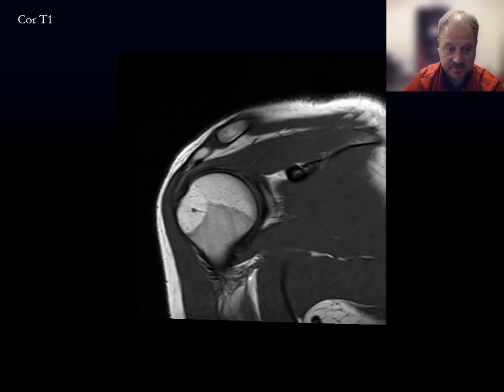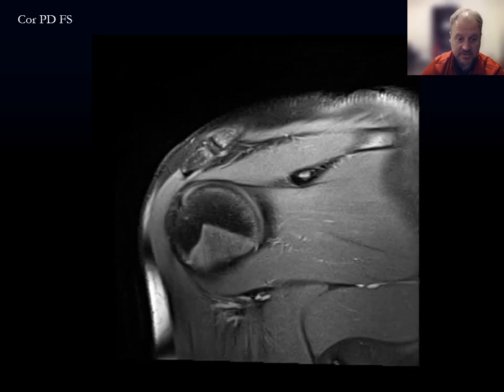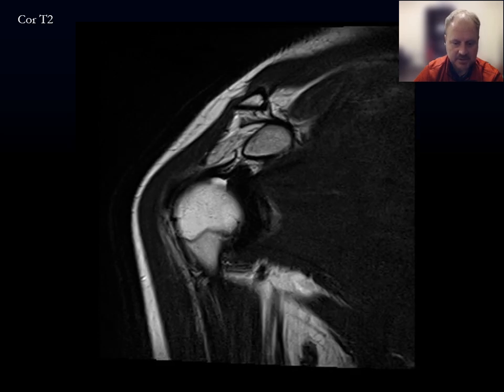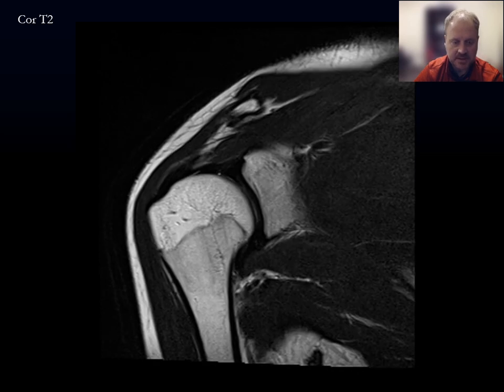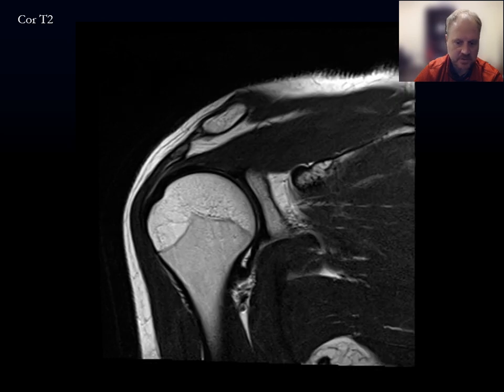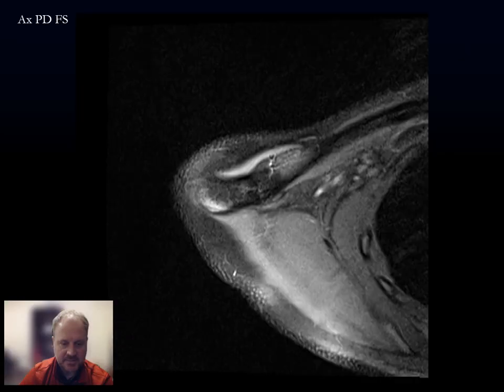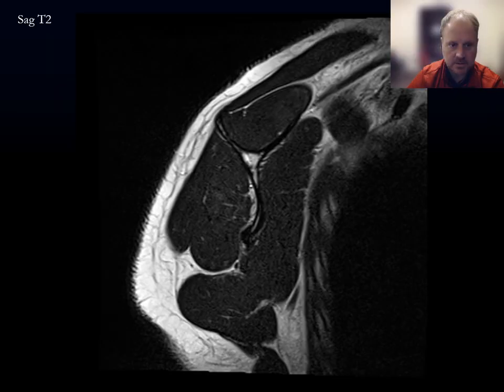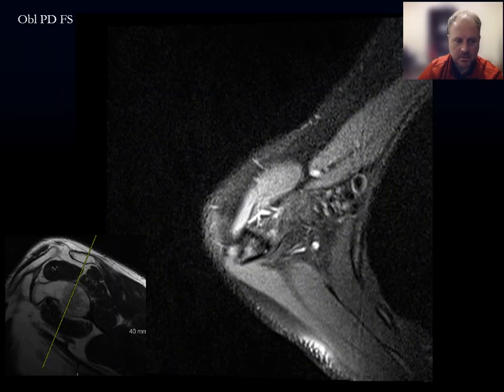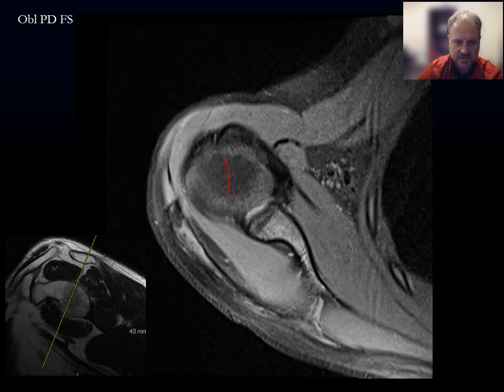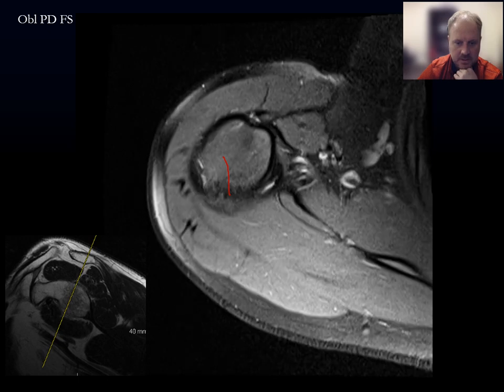The scrollable images are available for practice: coronal T1, coronal PD fat sat, coronal T2 without fat sat — useful for supporting findings of tendinosis and partial thickness tears, and notable for showing fat as bright since it is not saturated out on T1 and T2. Also available are axial PD fat sat and sagittal T2. Finally, the oblique sequence — always a nice picture to find the biceps coming across. Good luck in the bone room with shoulder MRI.